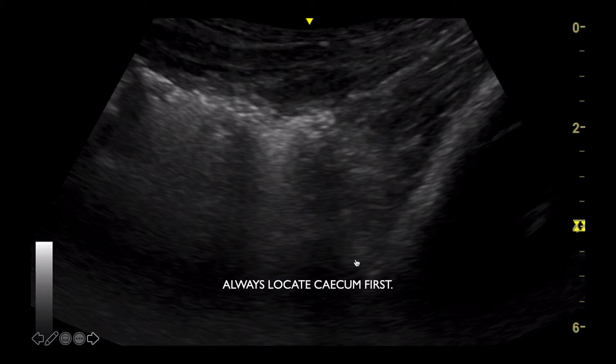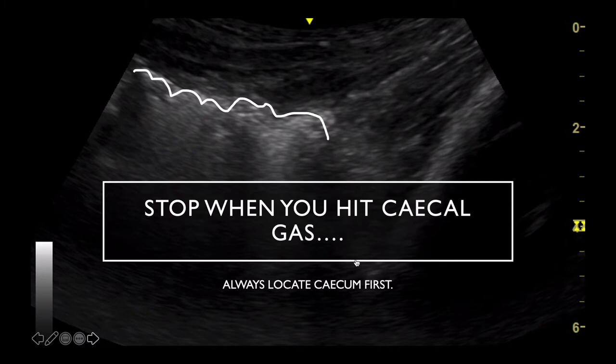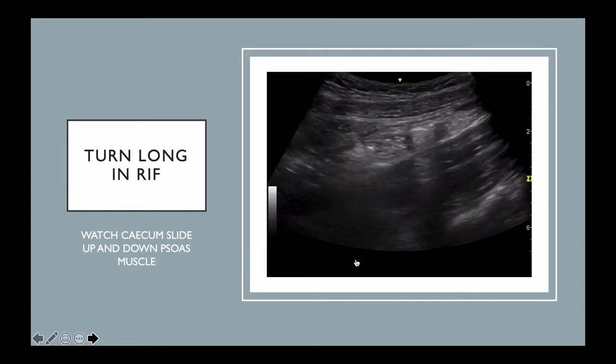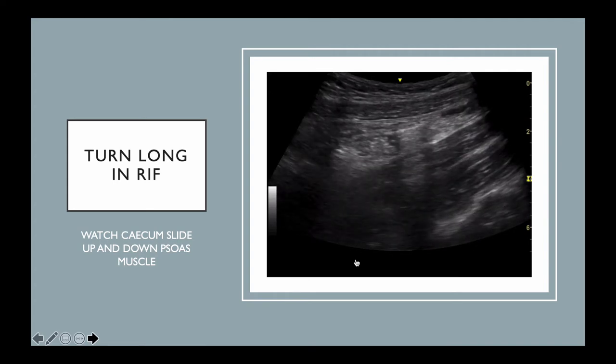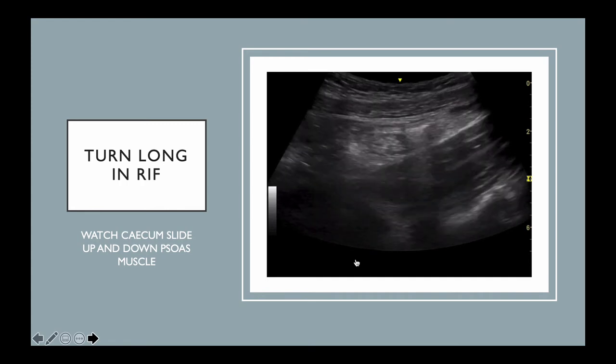If the cecum hasn't descended or if it's sitting in an odd spot, there's no point starting the fine search. This is the fluffy white cloud of cecal gas. I do like to confirm we're at the very end of this ascending colon, and I do this by turning longitudinally, and I like to watch that last bit of gas slide up and down with respiration on the iliopsoas muscles. People tell us that cecum should be retroperitoneal, but there's quite a bit of variability.